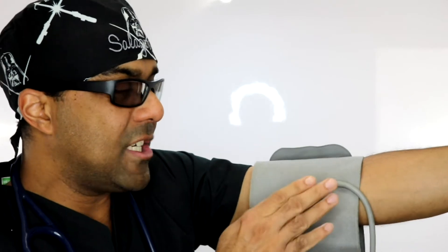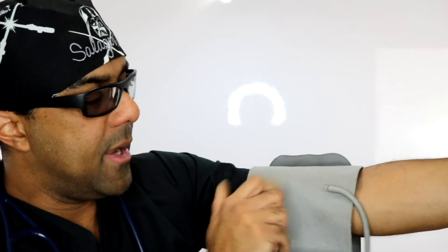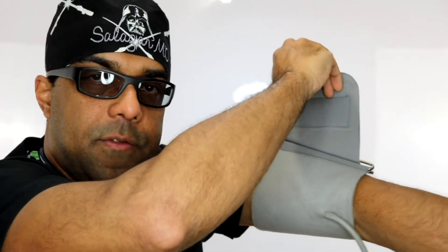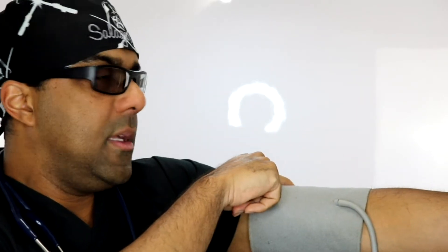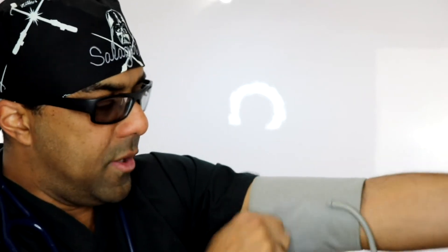Other than putting the cuff on backwards or upside down, another common mistake is that people slide it on correctly but when they go to tighten the velcro it shifts in position. You can see how by pulling here it migrates all the way over. The simple fix is to observe after you tighten the cuff whether it has shifted, and if it has, just pull it back to where you felt the pulse — that's where you want it.